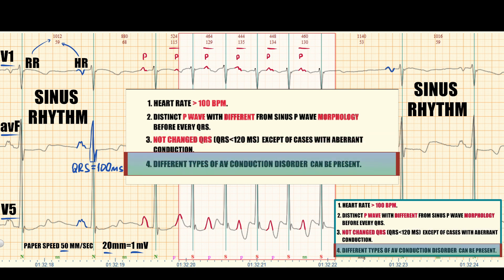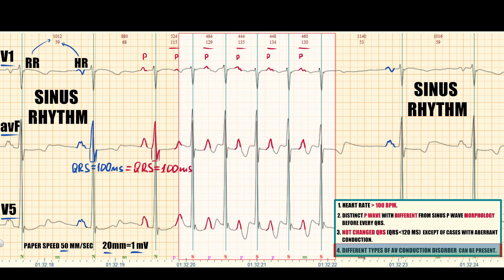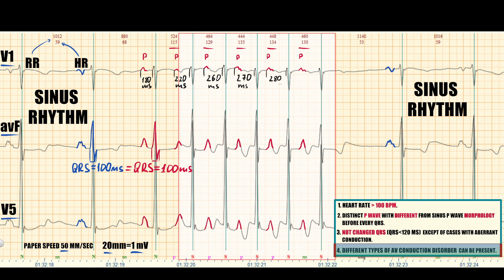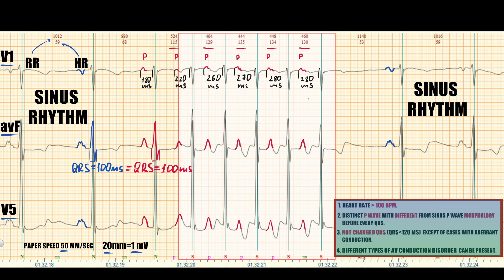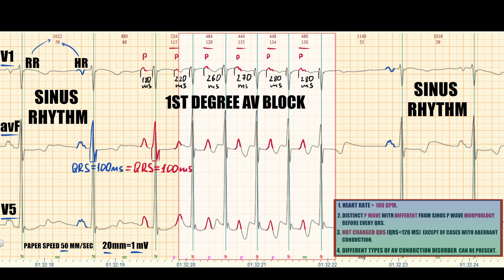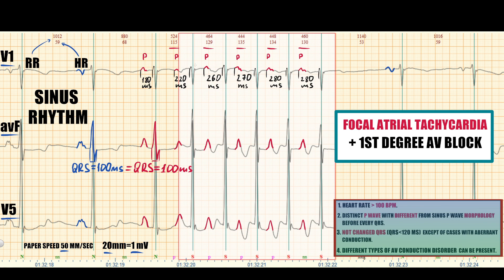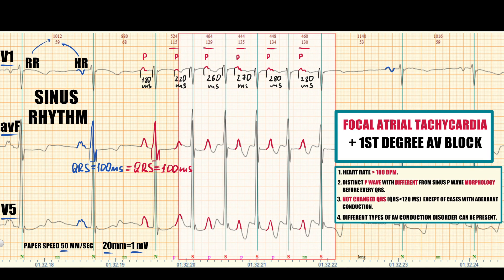Now we check AV conduction by measuring the PR interval. As the atrial rate increases, the PR interval becomes longer. A PR interval greater than 200 ms is called first-degree AV block. AV conduction changes are not mandatory or specific criteria for focal AT, but for a proper description AV conduction should be evaluated.